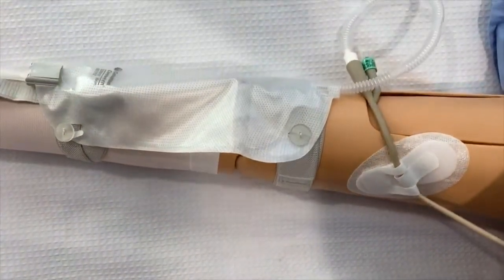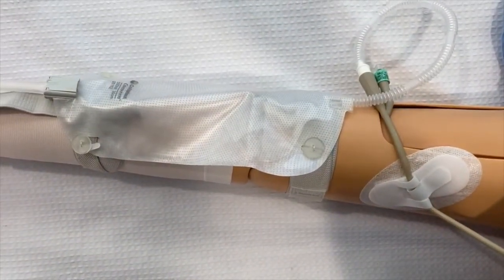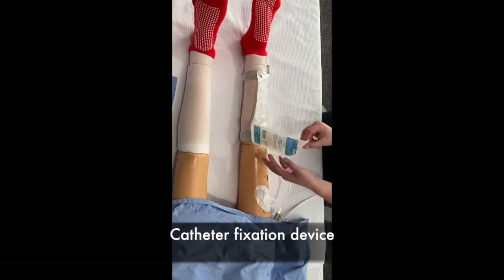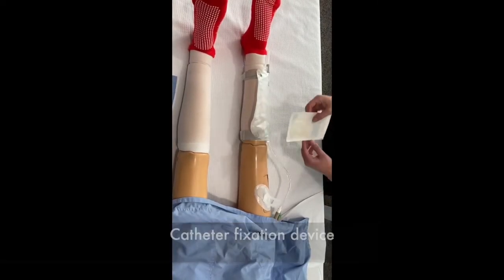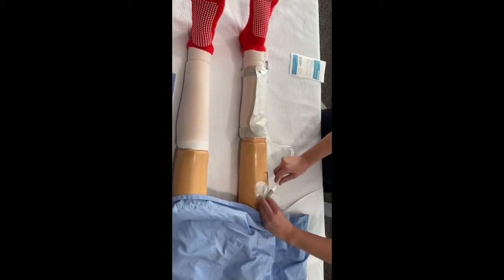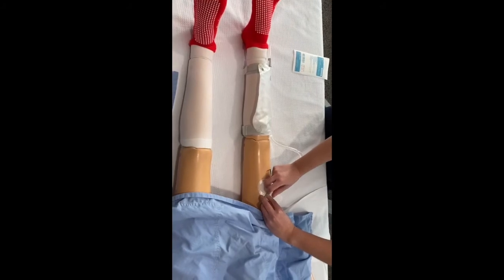Well done, you have successfully connected your new leg bag. This is known as a catheter fixation device. There are different types available. It helps to anchor your catheter to your leg, making it more comfortable for you.